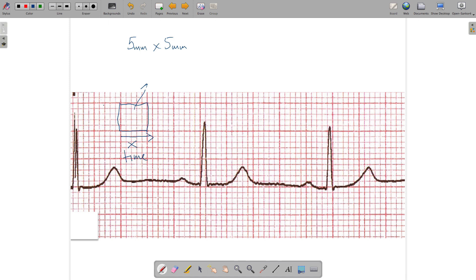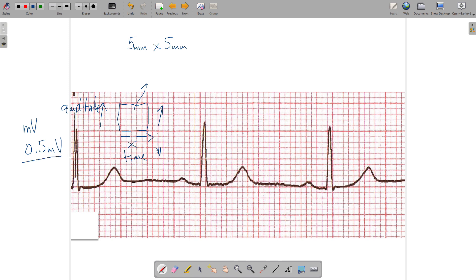The box also represents an amplitude, which is a representation of electricity. The millivolt unit is used to describe amplitude. Each big box represents 0.5 millivolts of amplitude. So any time we have a deflection, whether up or down, that deflection is representative of the amount of energy in millivolts being picked up by the electrodes and brought into the monitor.